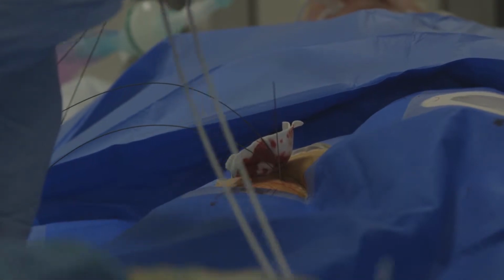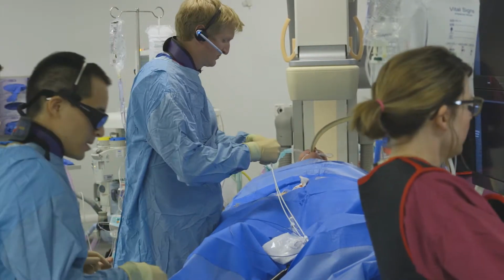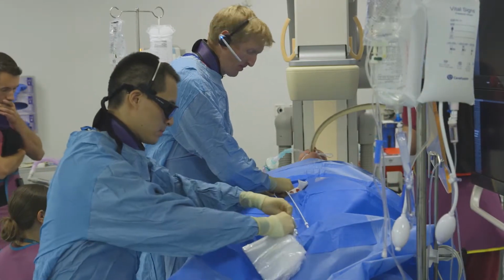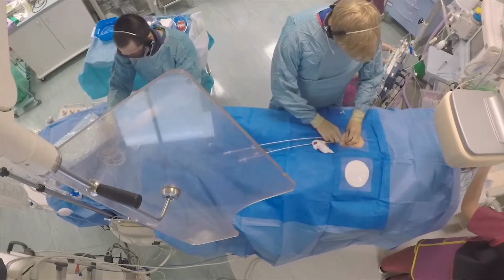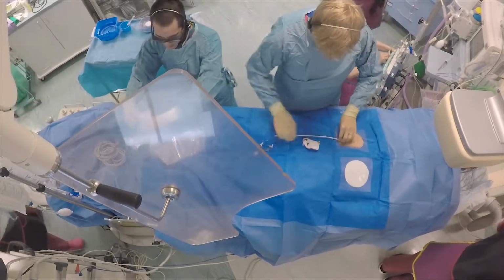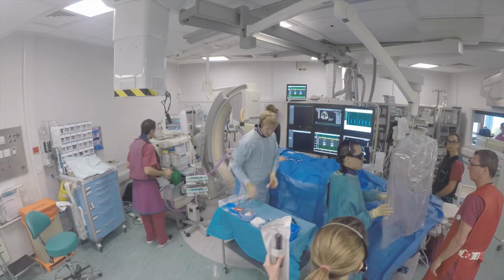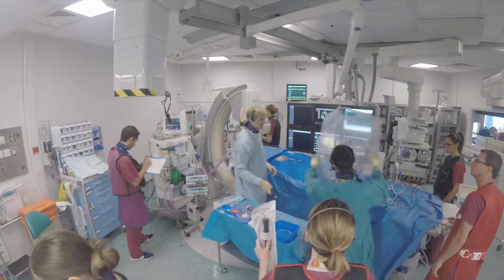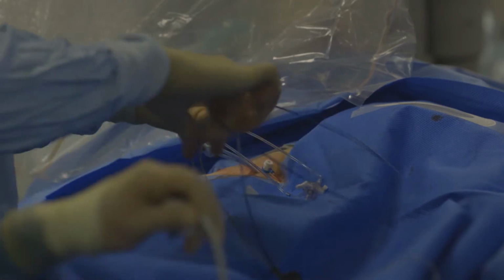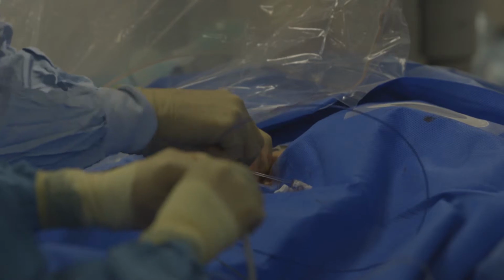I use a single transeptal puncture and place both catheters through the same hole. If this proves difficult, I will then do a second puncture if required. This is rarely the case. If there's a PFO, I will use that, but if it feels that it will be difficult to perform the case, I will have a low threshold to moving towards a transeptal puncture.